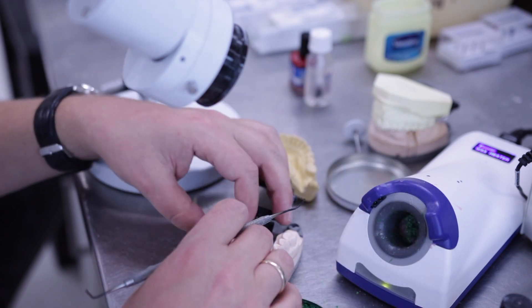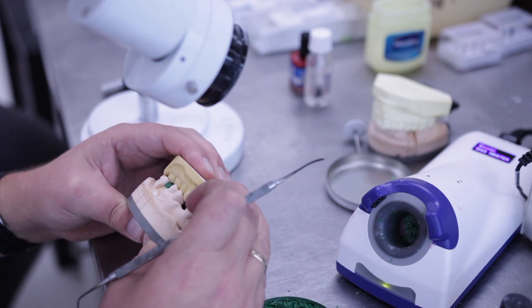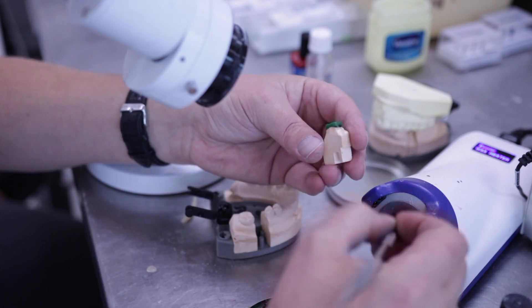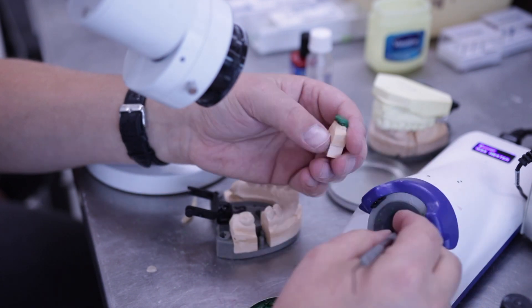Visualise a full anatomic crown and then reduce 20% so you have enough space for your porcelain. An ideal thickness of the metal framework and the porcelain is approximately one millimetre.